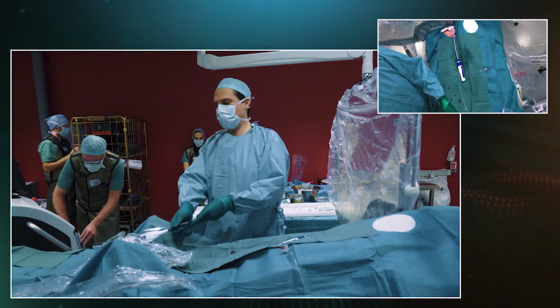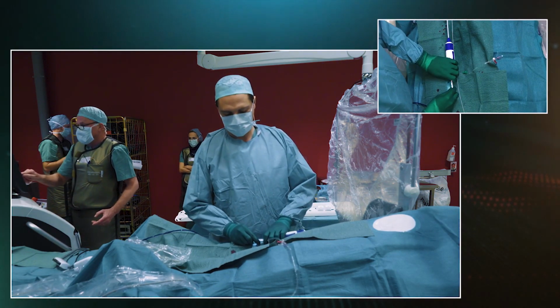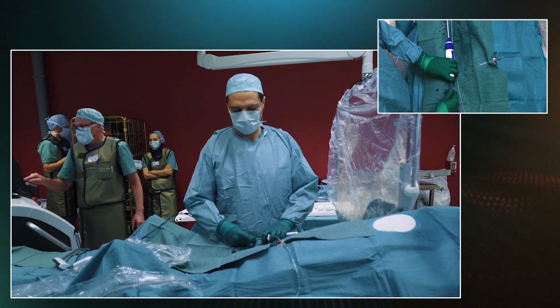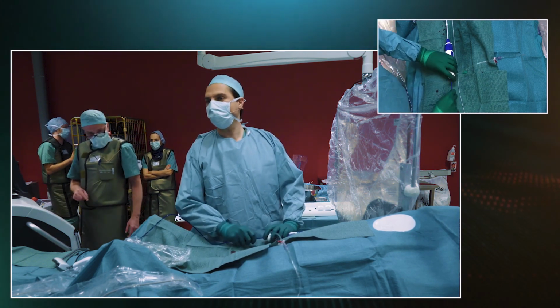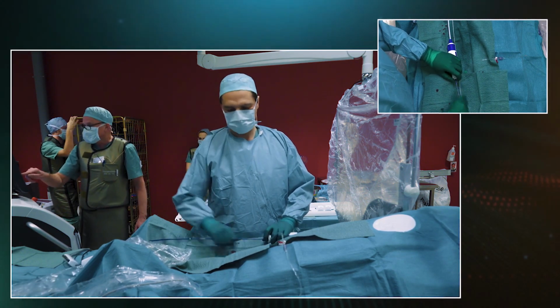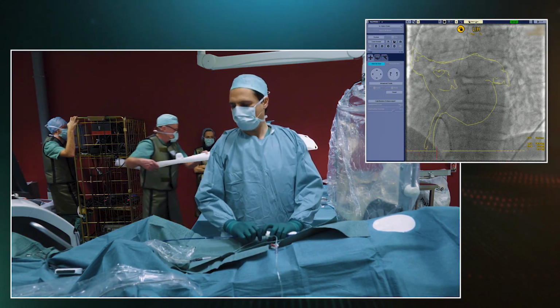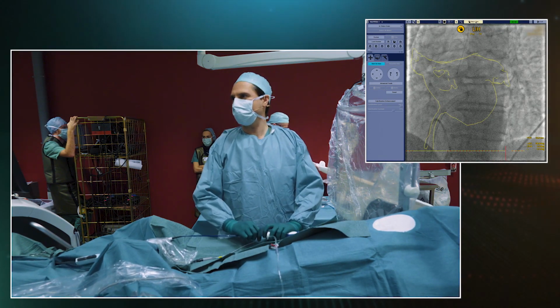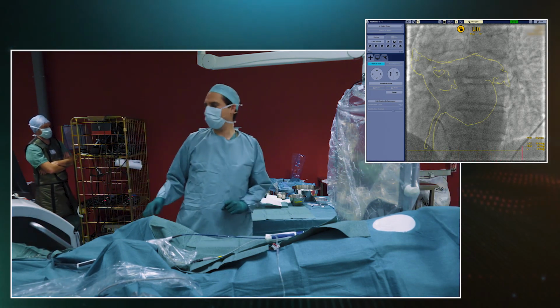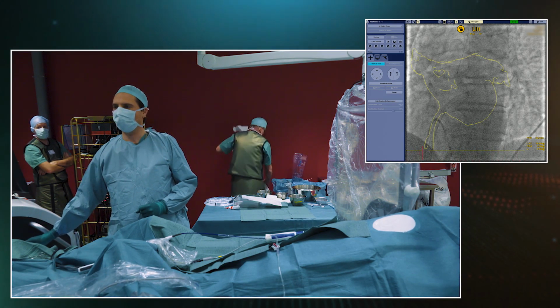Groin puncture 1526, it's now 1546, 20 minutes after groin puncture, we're ready to start our ablation. Single-handed, no extra help for the balloon setup. So we're ready. As always, I'm going to try to do a procedure that is as standardized as possible, that follows the same template, follows the same general approach as we do for all our balloon procedures.